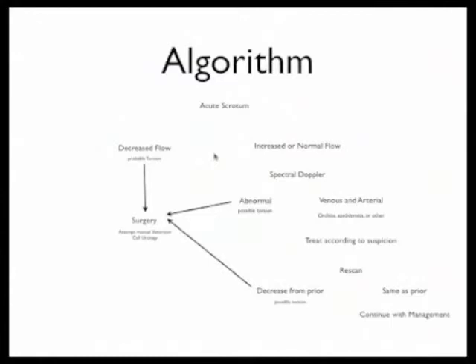And then if it's still increased, then there's not much to worry about if there's just increased flow and you know it's staying increased. That's pretty clearly orchitis or epididymitis. So that makes a lot of sense to me.